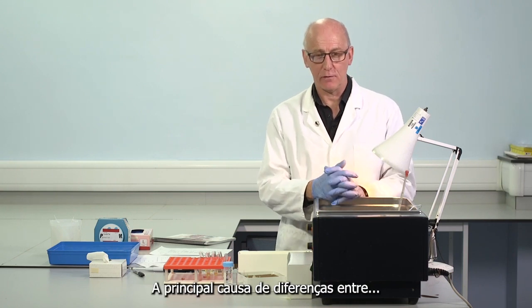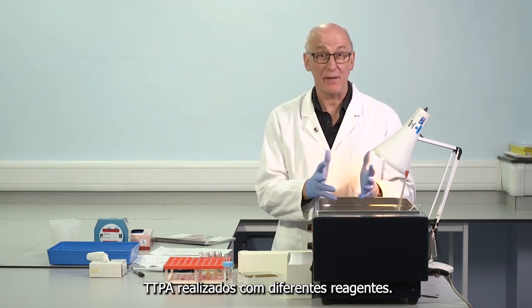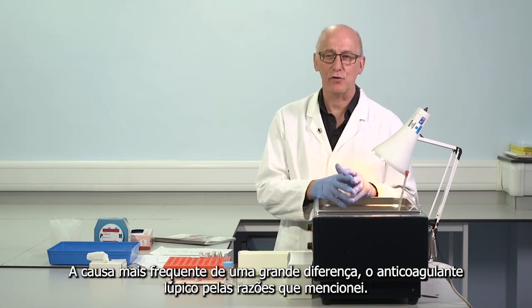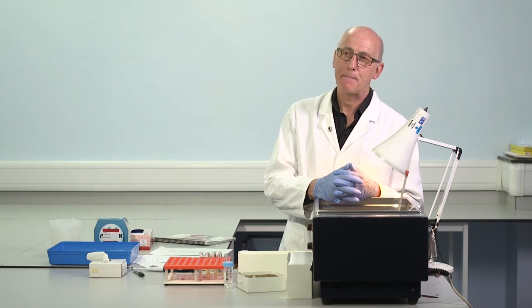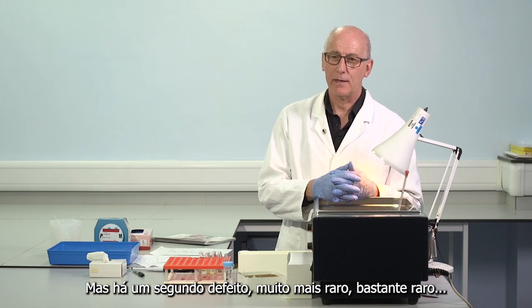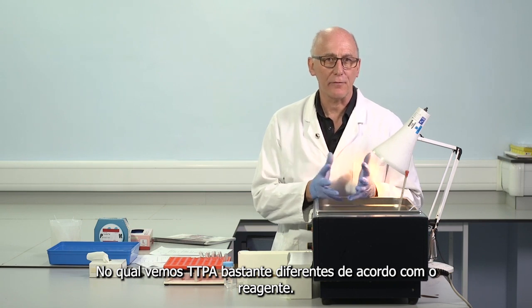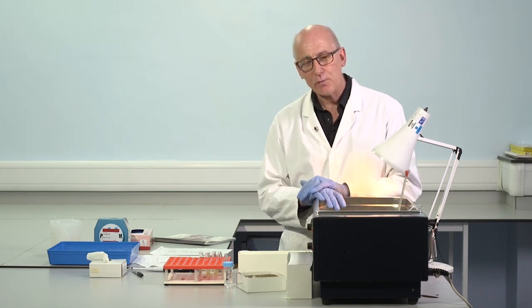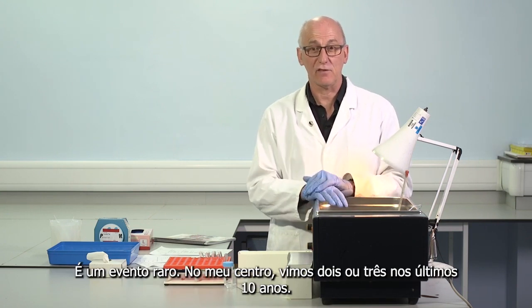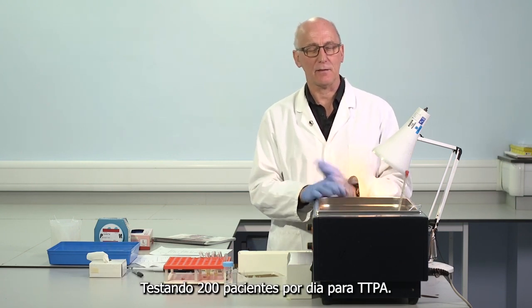The main cause of differences between APTTs performed with different reagents. The most frequent cause of a big difference, lupus anticoagulant, for the reasons I've mentioned, it's all about the phospholipid concentration. But there is a second, much rarer, defect in which we do see quite different APTTs according to the reagent. And that's patients who have pre-kallikrein deficiency. It's a rare event. In my centre, we've seen 2 or 3 over the last 10 years testing 200 patients a day for APTT.